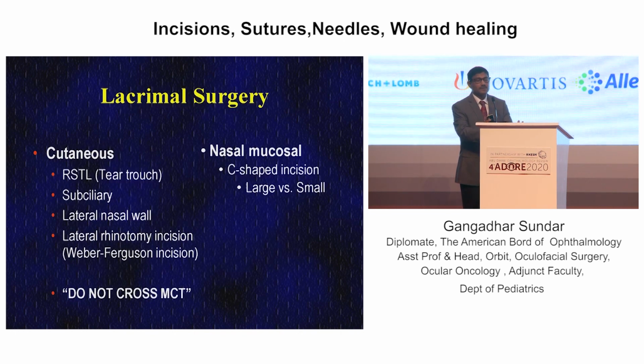So coming to lacrimal surgery, what are the incisions that we make? Yes, we still do a few external DCRs, but the vast majority of lacrimal drainage surgeries are now endoscopic DCRs, at least in our practice. But the regular resident, the ophthalmologist and the junior oculoplastic surgeon have to become familiar with an external DCR. And once again, we are looking for natural existing lines on the face, and typically in the tear trough deformity where you have the relaxed skin tension lines.